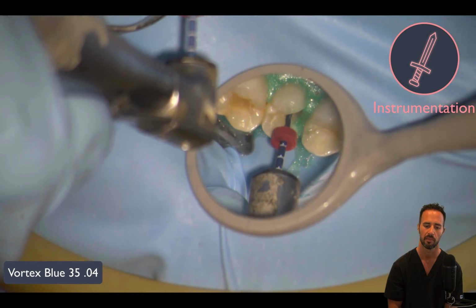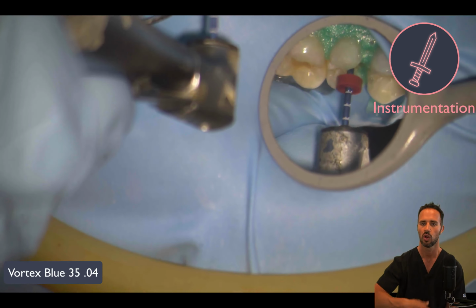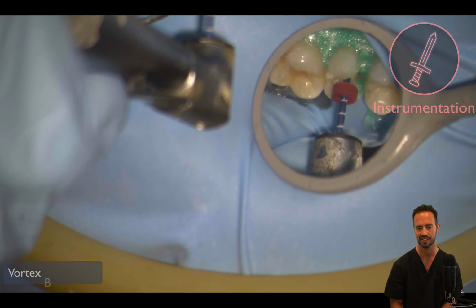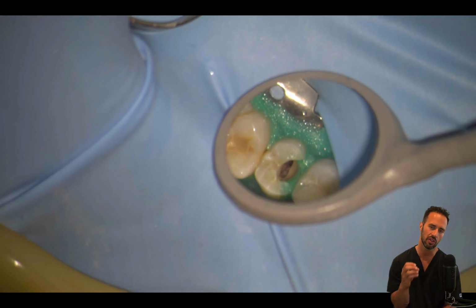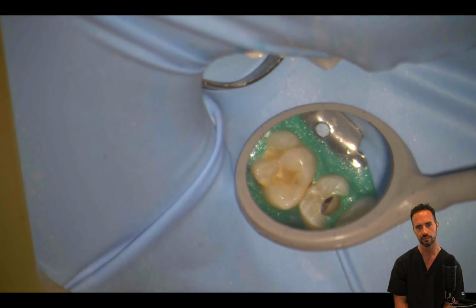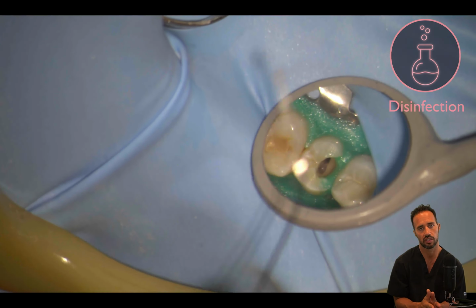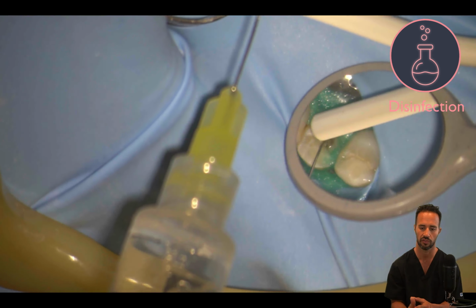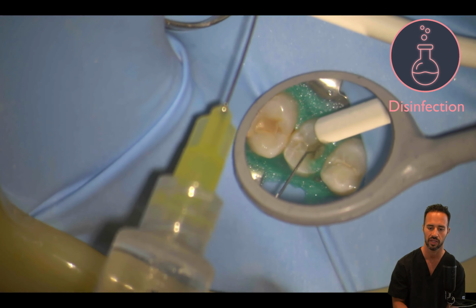Okay, so the instrumentation phase doesn't really need to take this long once you kind of learn the dance with your assistant. Okay, and you guys are in the groove. Okay, but that's our final shape. You can feel the resistance on the file in the apical area, and that's how you know you're fully debrided. You can finish at a smaller file, you can finish at a larger file, but you just don't want to push any file that's too fat all the way to length.